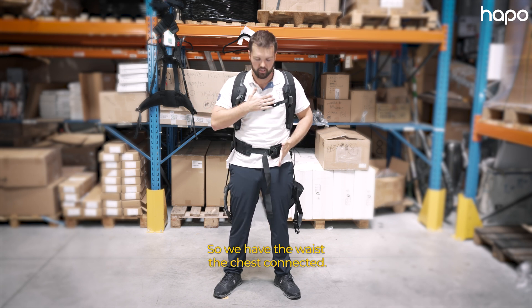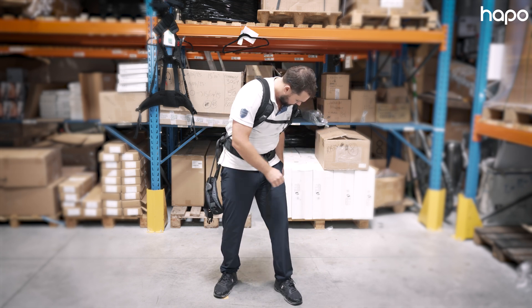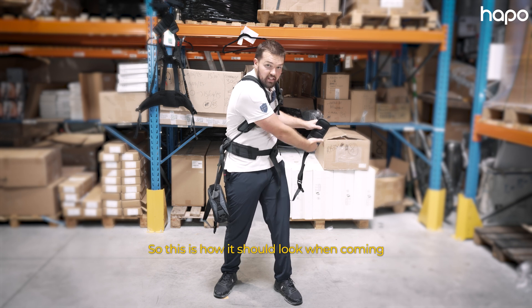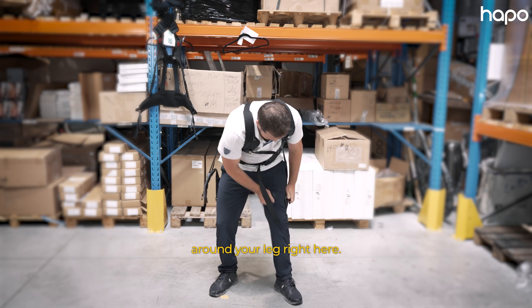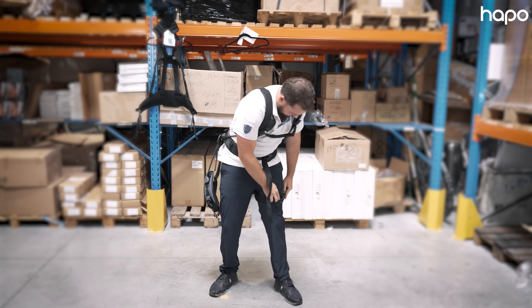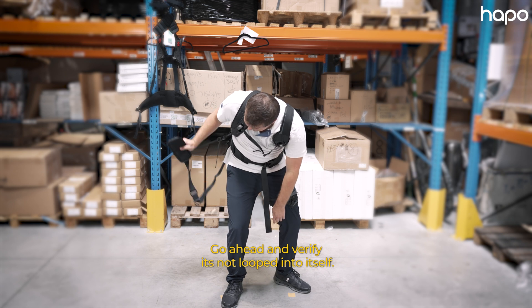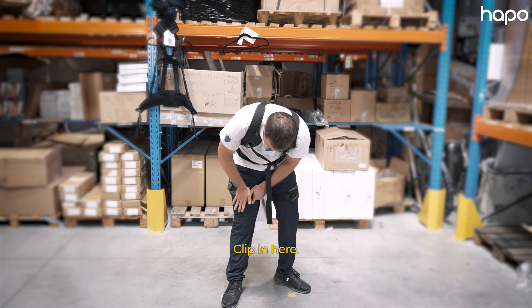So we have the waist and chest connected. Now we're going to connect both leg straps. Make sure the strap is not caught into the spring — this is how it should look when coming around your leg. Go ahead and clip this in. Now have the spring line up with the seam of the pants. Go ahead and verify it's not looped into itself, then clip in here.